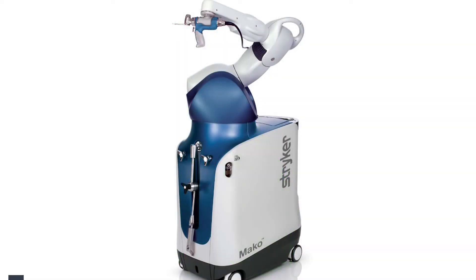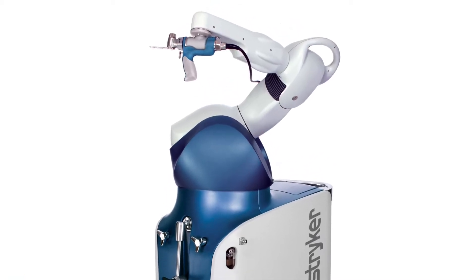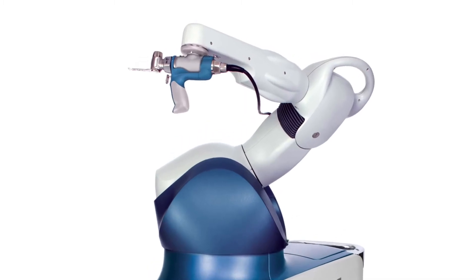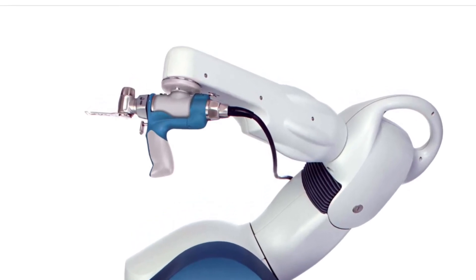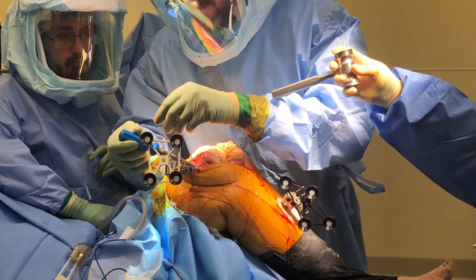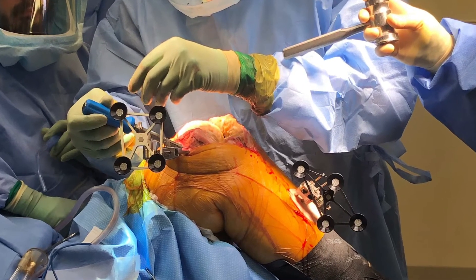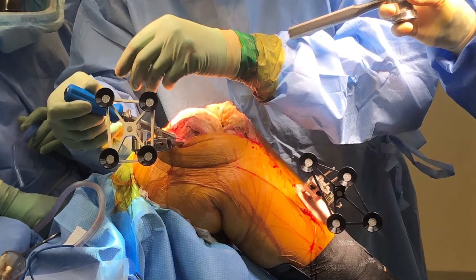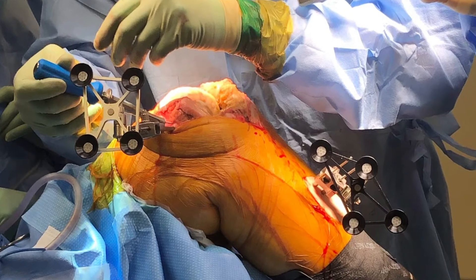Once we have our implant positions perfected, we bring the robot in — it has wheels and slides in next to the patient. At the top is the robotic arm, which controls where the saw blade is in space. The robot doesn't move the saw blade back and forth — I have to do that — but it keeps me in plane and within boundaries to protect vital structures. Before bringing the robot in, I attach jigs to the femur and tibia so the robot knows where the knee is in space and can predict what the gaps are going to be before we cut.